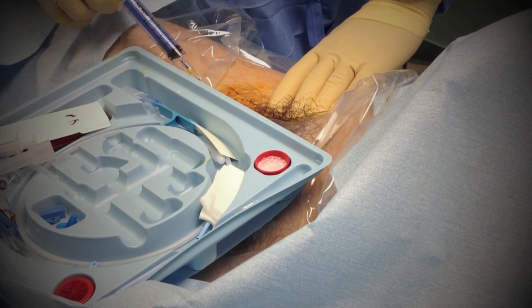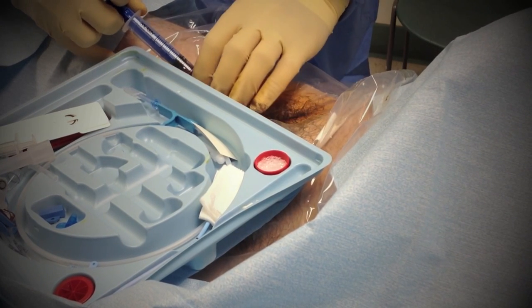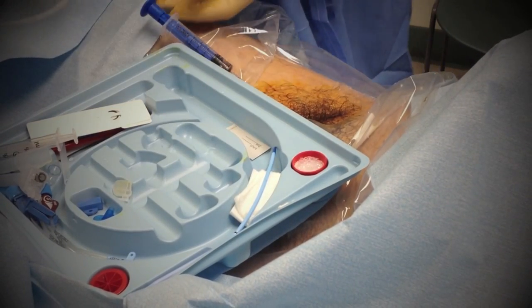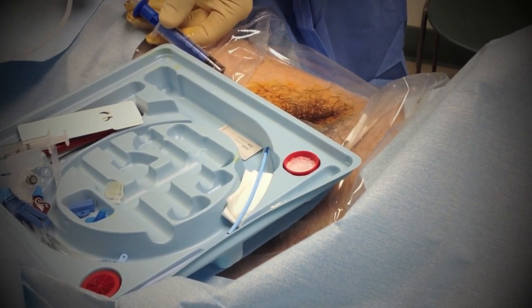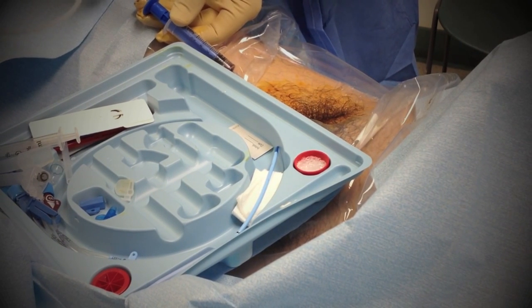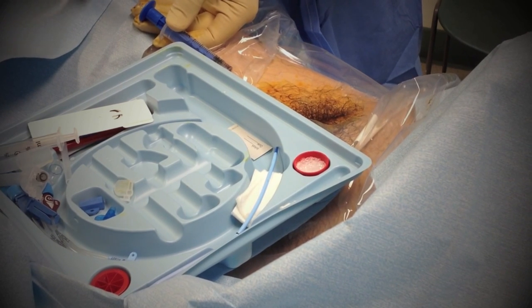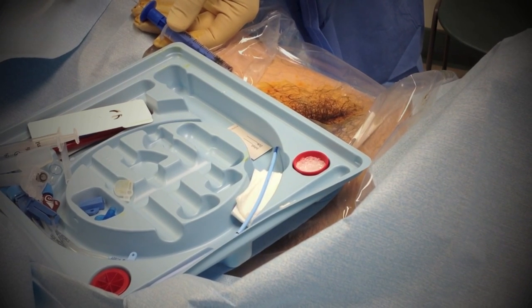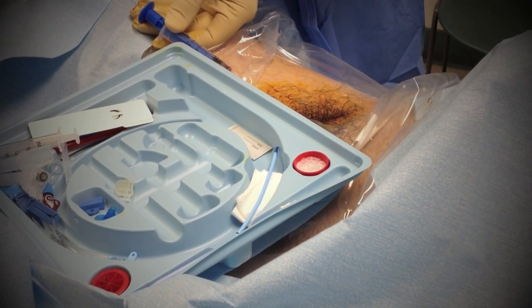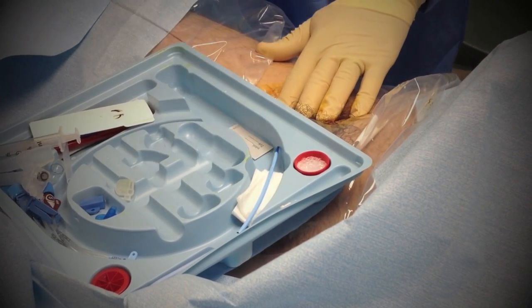Just medial to that pulse, we'll use the guide wire. It's called the Seldinger technique — Seldinger invented it. Use a wire to save your spot and line, if you will, to know that you're in the right place.